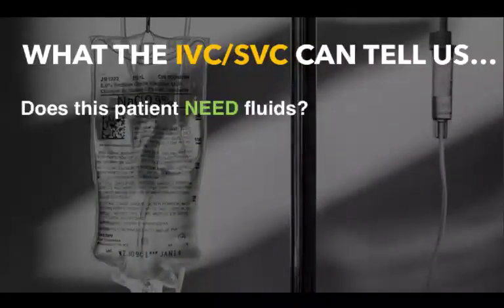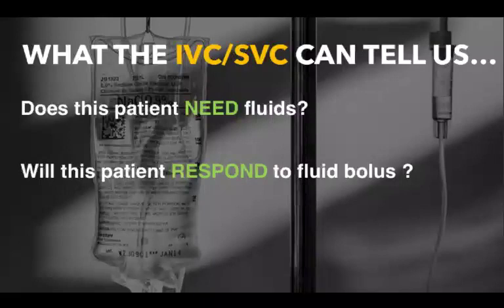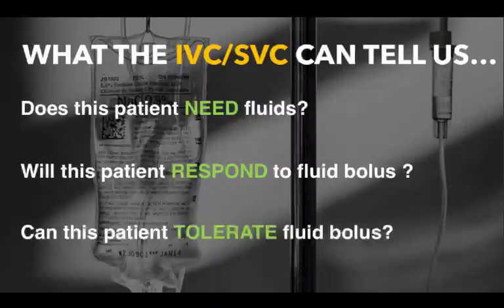So what can the IVC or the SVC tell us with ultrasound? Does this patient need fluids? Does this patient respond to fluids? Can this patient actually tolerate a fluid bolus? Well, the answer to the first question is nope. It can't really tell us anything about the need for fluids. Will this patient respond to fluids? Yes, there's a fair amount of data demonstrating that we can separate responders from non-responders.